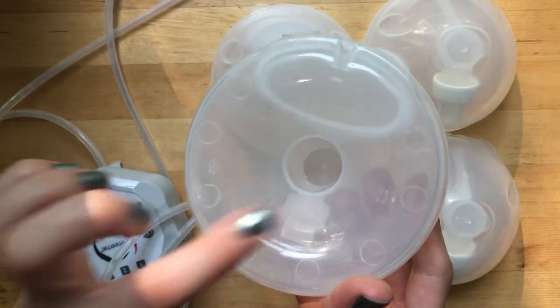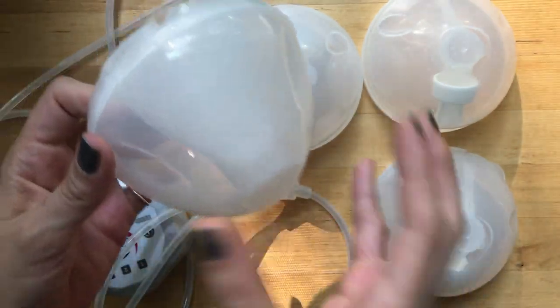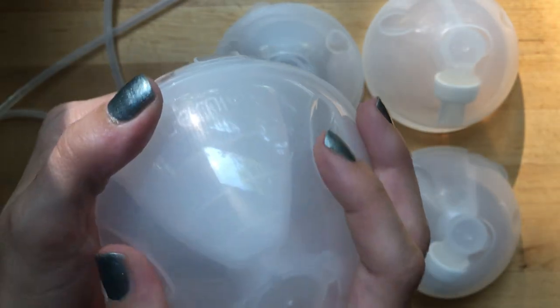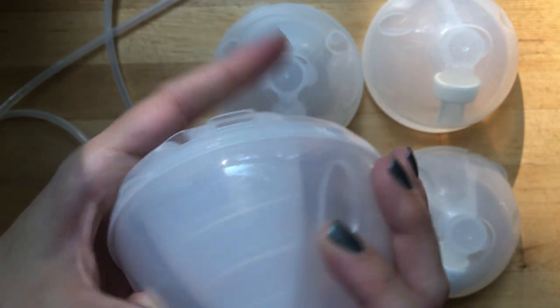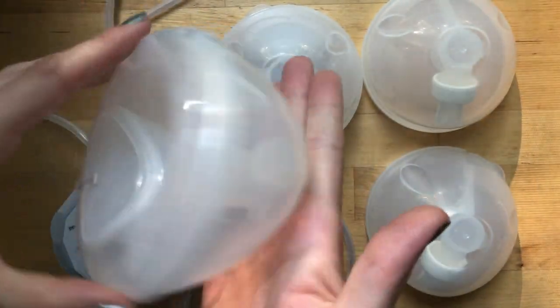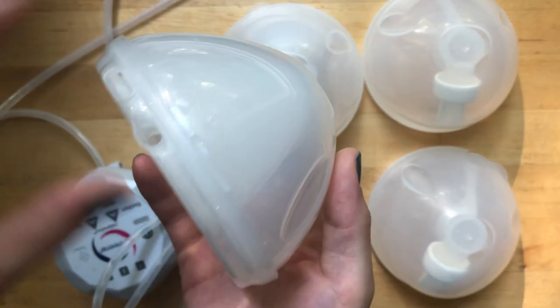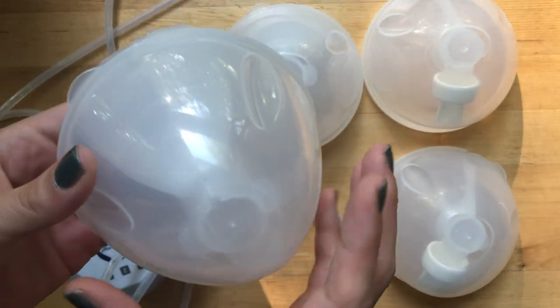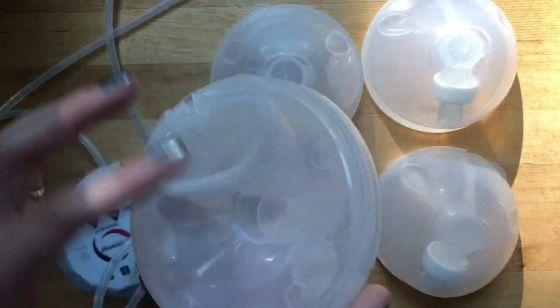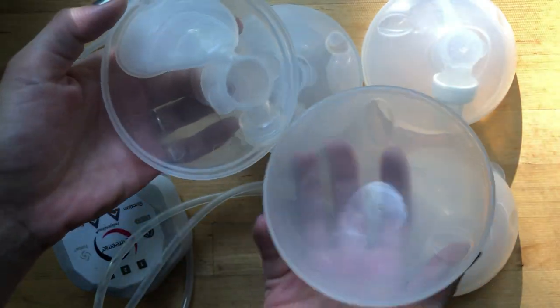This comes with the 25 millimeter flange - that hasn't changed from the old version. It's got little grippers to pull the cup out, and a little tab to get a good grip, though sometimes it is difficult to get out. On the side it gives you measurements for when it's sitting flat and also for when it's upright, which is what you'd be looking at while wearing it. I'm not sure how accurate those measurements are.